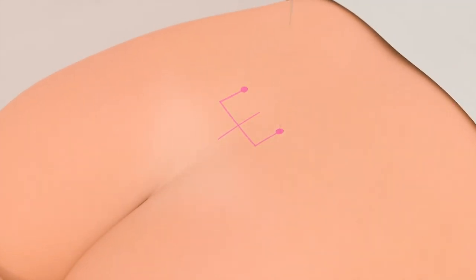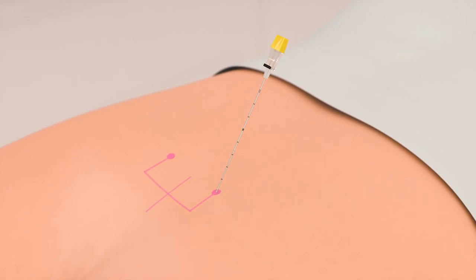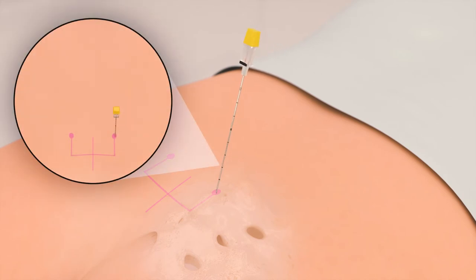Local anesthetic is used at both needle entry points. The foramen needle is advanced, keeping it parallel to the patient's midline, and at an approximate 60 degree angle with the skin. Slight adjustments in the angle of the needle or needle entry point may be required to access the foramen. While adjusting the angle, always keep the needle parallel to the midline.